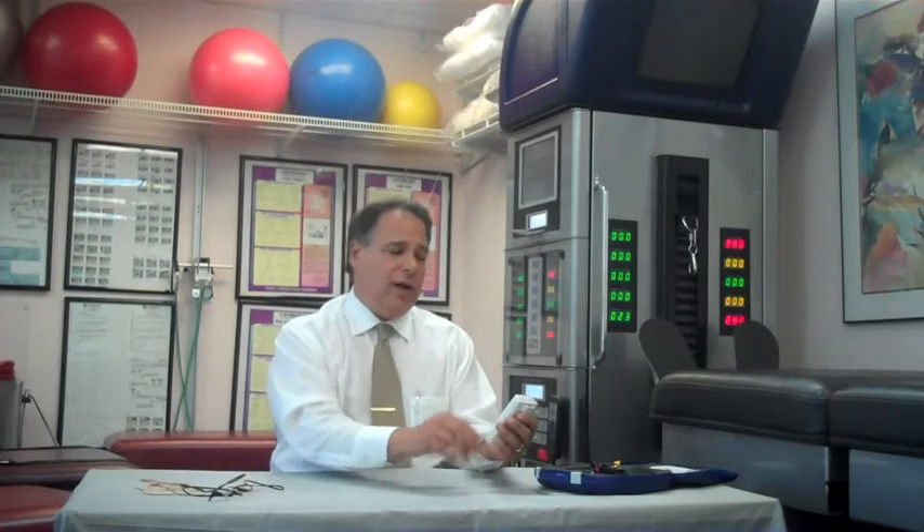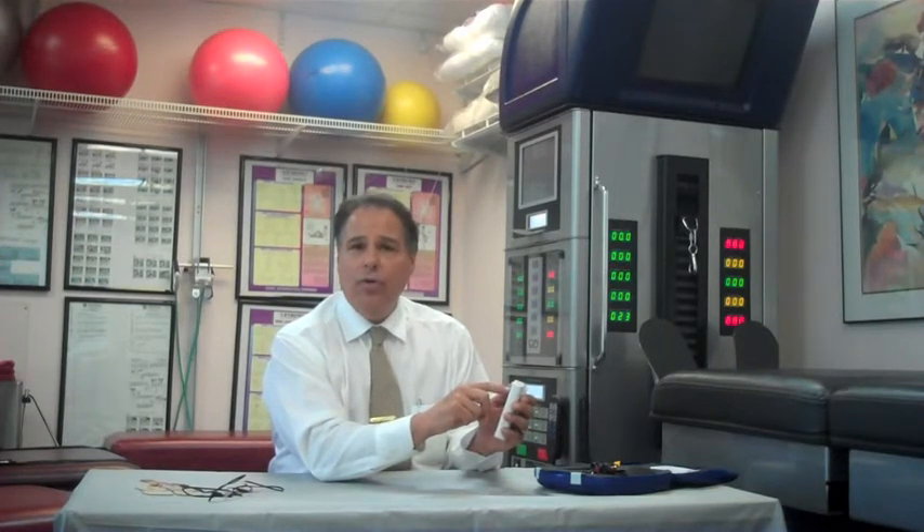In normal mode, the electrical stimulation will be felt in continuous format throughout the duration of treatment. In M mode, the pulse width will vary up and down throughout the duration of treatment. In M1 mode, the pulse rate will vary high and low throughout the duration of treatment.